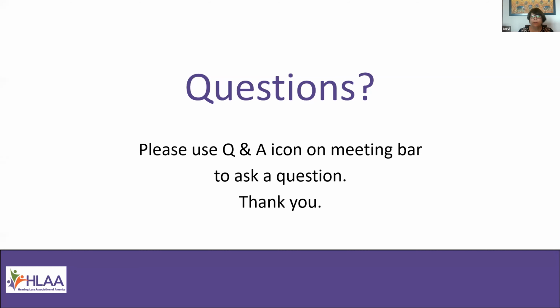Here's another question. They want to know if we plan to add ASL Sign Translation for the deaf who don't speak well. Great question, and the short answer is no. We are not allowed to. It's not that we don't want to, but once again, as I mentioned, we are restricted by the IP CTS regulations. ASL or any kind of translation service does not fall within our purview or what we're allowed to do. Unfortunately, that would be a different app that we would have to build, but not on the CaptionMate platform.